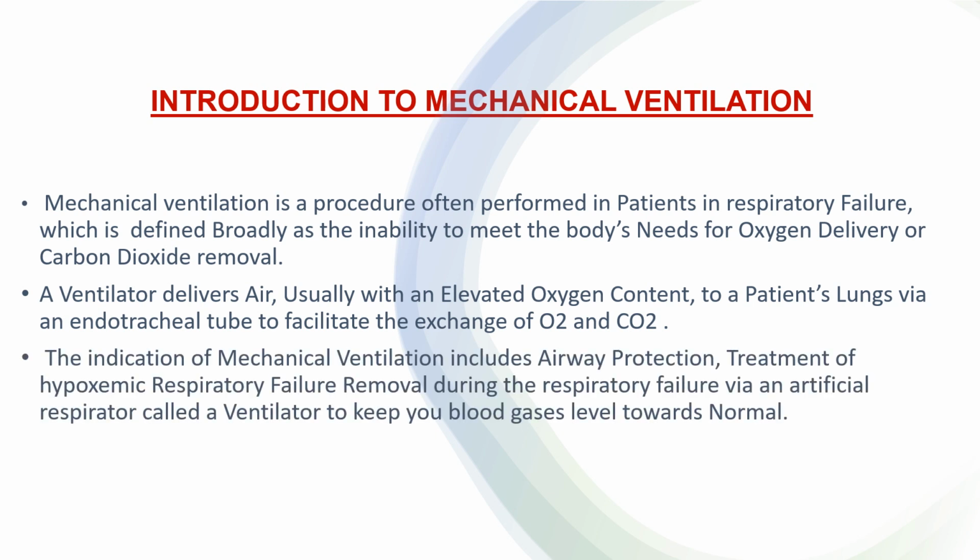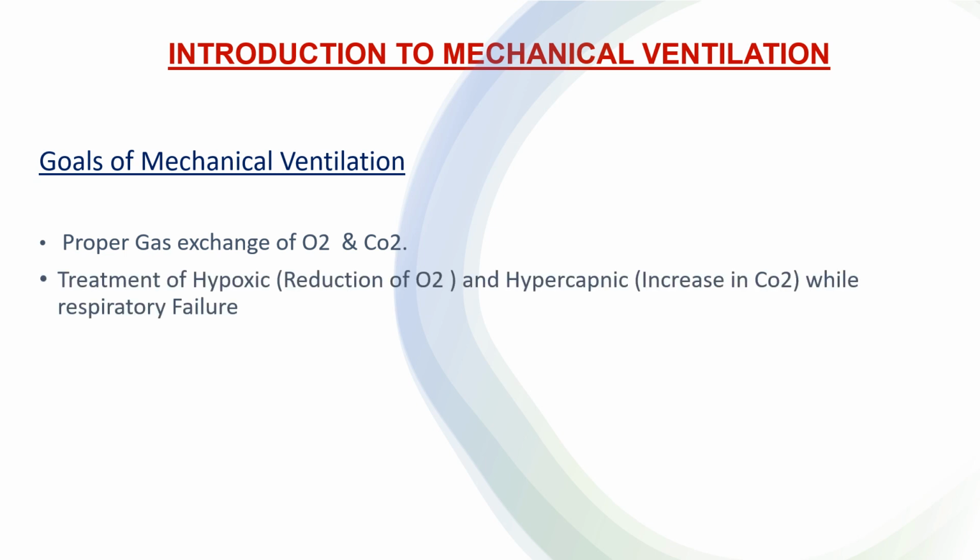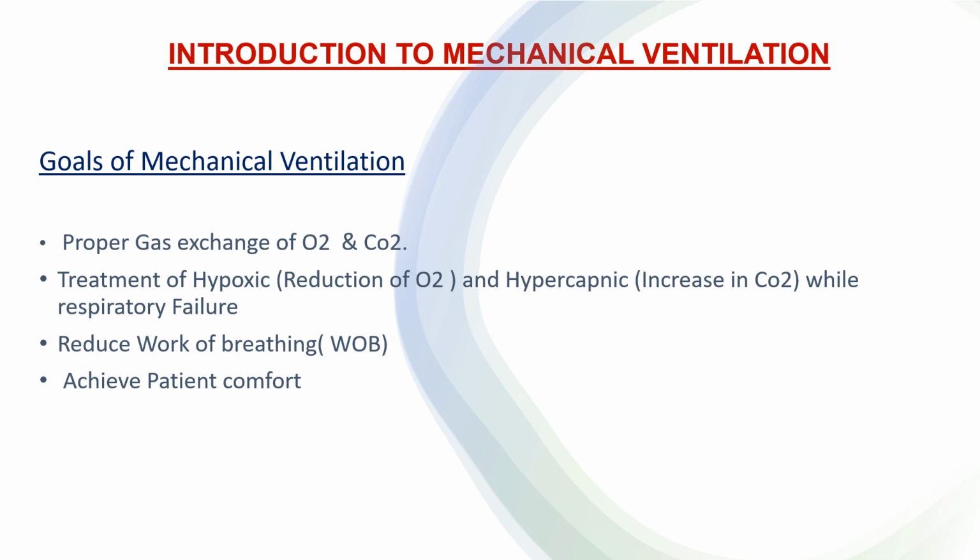The indications of mechanical ventilation include airway protection, treatment of hypoxemic respiratory failure, and removal of CO2 during respiratory failure via an artificial respirator called a ventilator to keep your blood gases levels towards normal. Goals of mechanical ventilation: proper gas exchange of O2 and CO2. Treatment of hypoxic and hypercapnic respiratory failure. Reduce work of breathing. Achieve patient comfort.